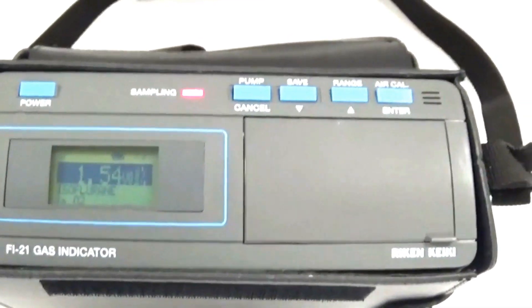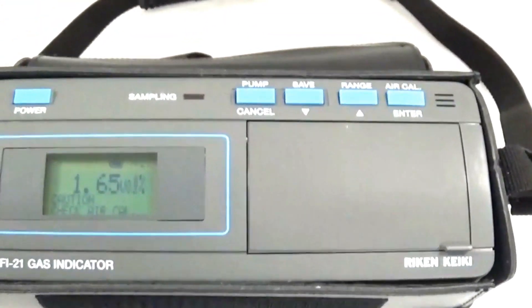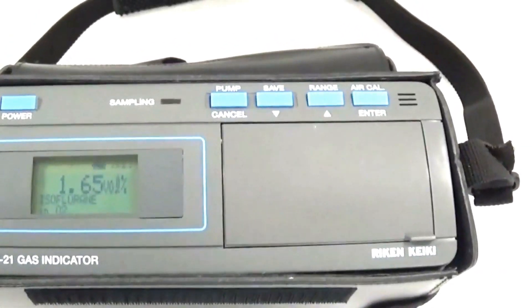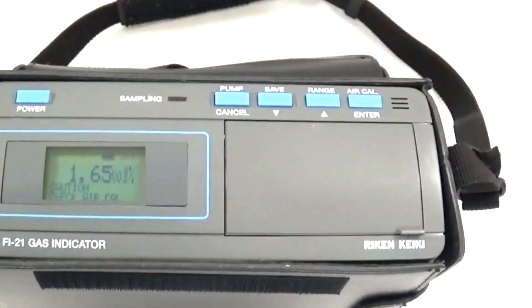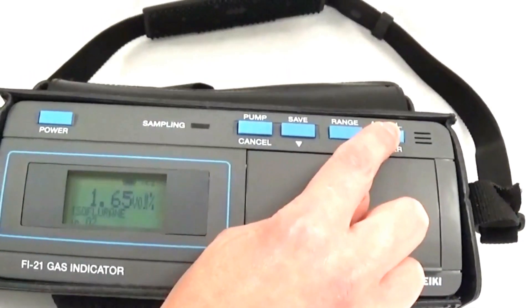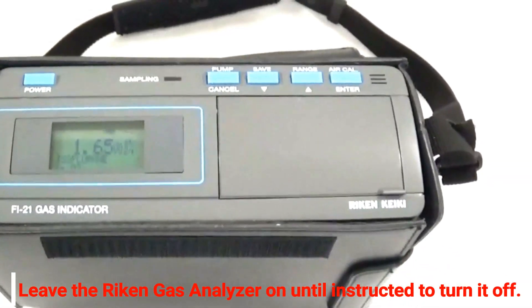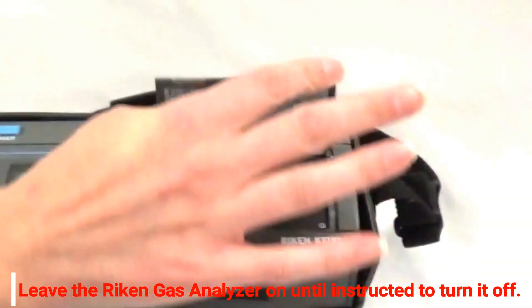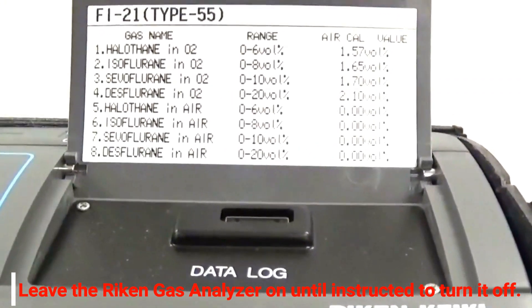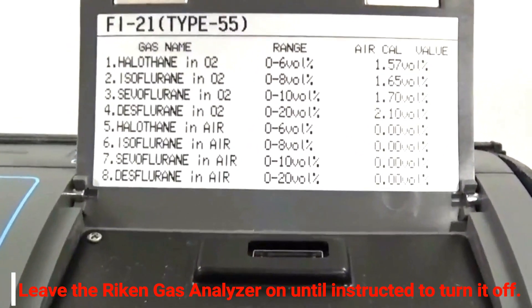As you can tell, the number has stabilized, so we will cancel the pump. The number comes up to 1.65, which is exactly what we want. We can now press Enter. If for some reason the number was off by one or two points, we can hold down the Enter key — the unit will beep and 1.65 will appear. To see all the Air Cal values, open the flap in front of the Riken, and there are the Air Cal numbers for each anesthetic agent.